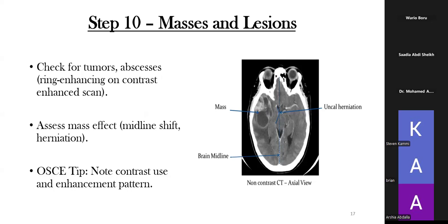So there are about 8 things I believe I've mentioned. So name 1, age 2, gender 3, when was it done 4, the cut 5, the modality, you have to say that this is a head CT scan, or if it's an MRI, that's 6. I've said the cut, then you talk about the window, that is 7. Then the extent, 8. So in that stage, for all of you who are attending the meeting, there are 8 things that you must always introduce. You get your marks on that.